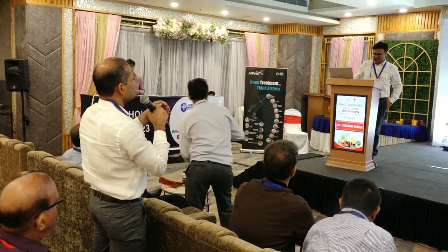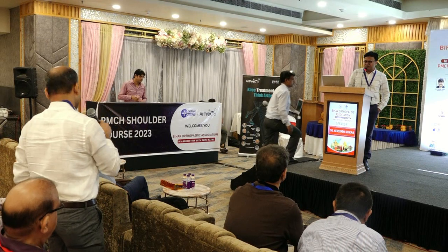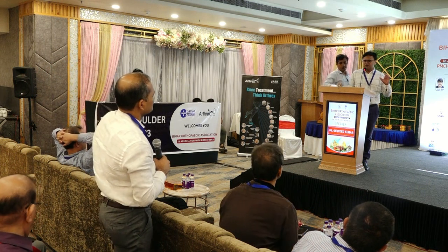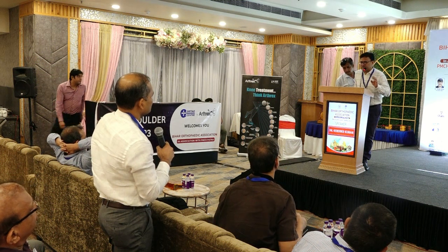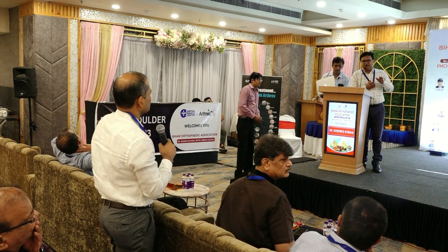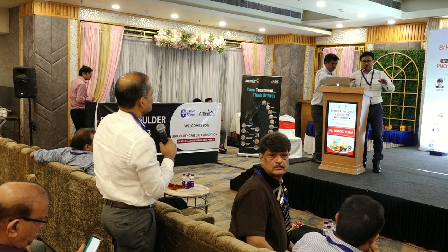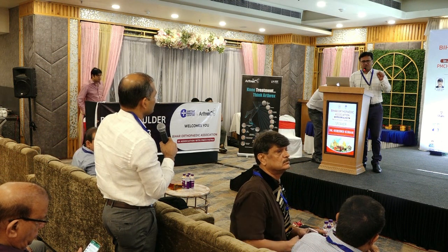For the beginner, those who have started doing shoulder arthroscopy, the posterior portal is the foundation stone for any further surgery of the shoulder arthroscopy. We generally do it in the lateral decubitus position. The patient lies 30 degrees posteriorly because you have to keep the glenoid parallel to the floor.